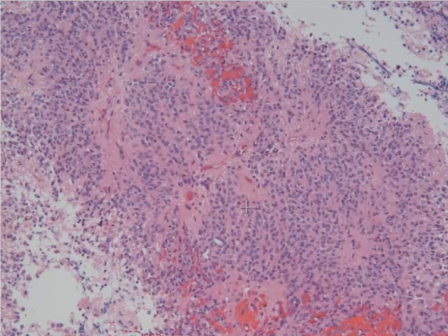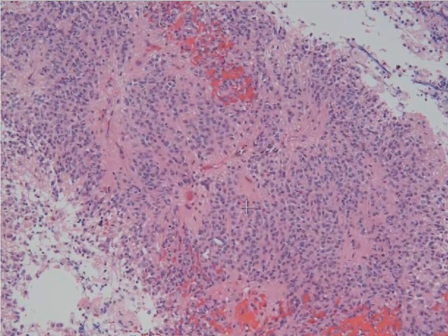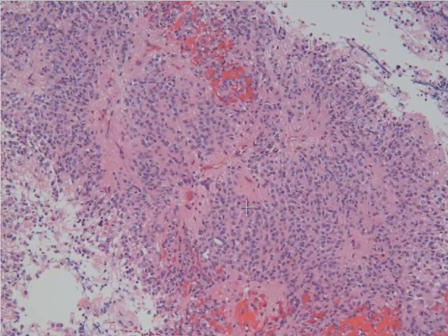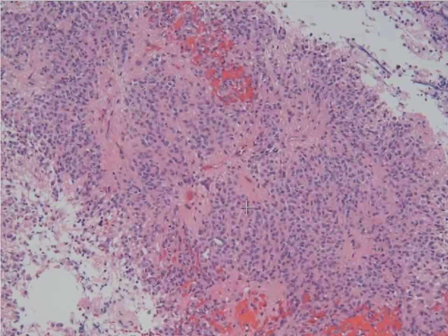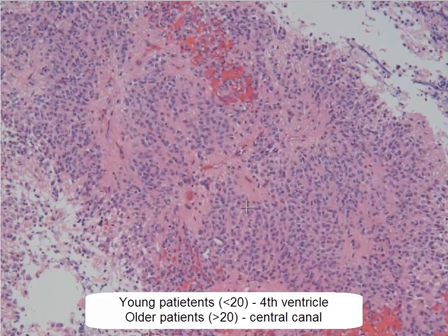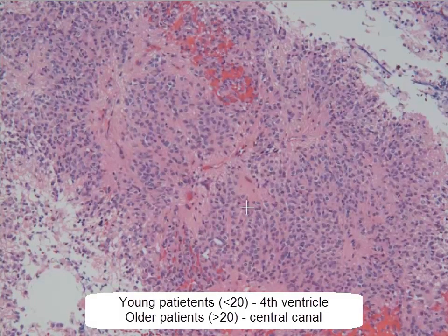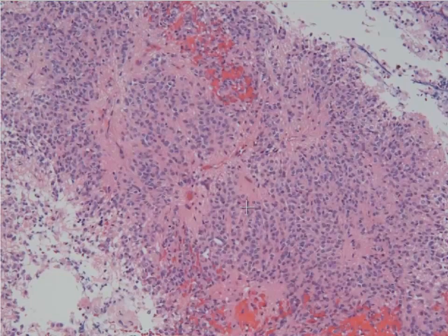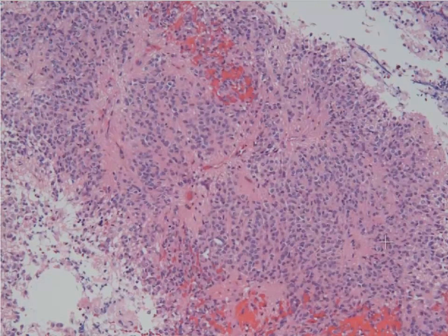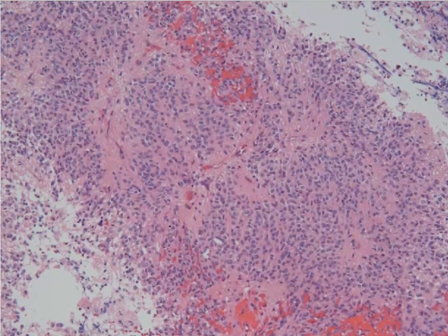Ependymomas occur in the ependymal-lined ventricular system. In young patients, they're going to happen usually in the cerebellar area, and in older patients, they're going to happen mainly in the spinal cord. This is a great example of an ependymoma in an older patient, so this one would most likely be located in the spinal cord.